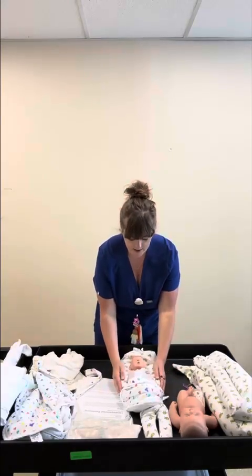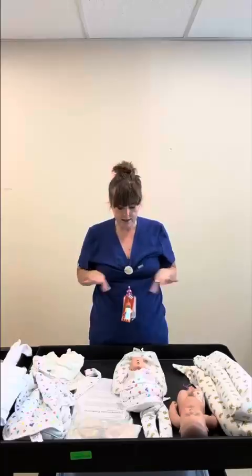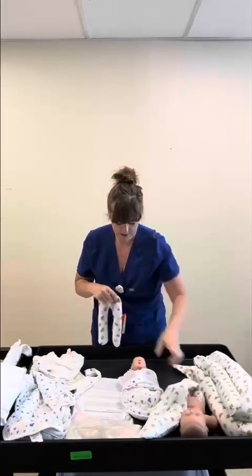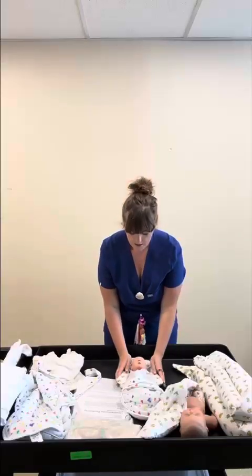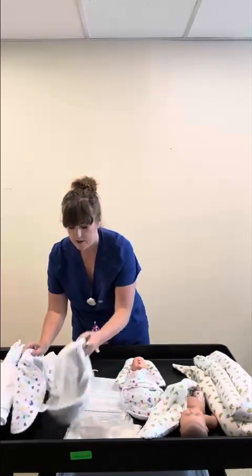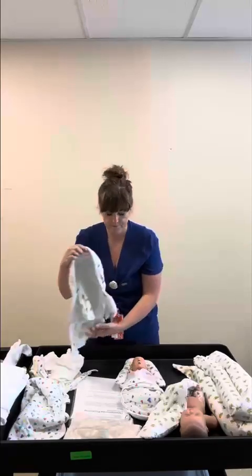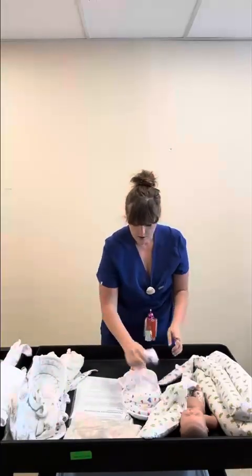But as long as they're tucked in 360 degrees, you can use either size. We have 2 sizes of these, depending on what size your baby is. For our littlest babies, you do not want to use the Dandle 2s, and I'll explain that in the next scenario.